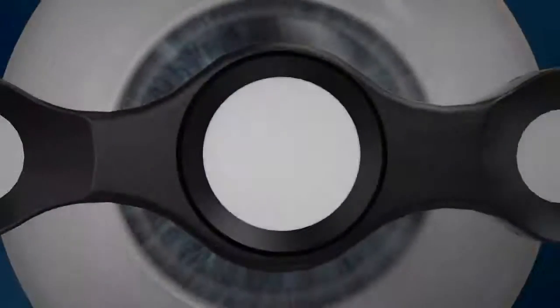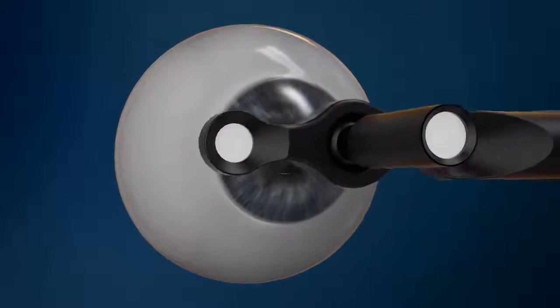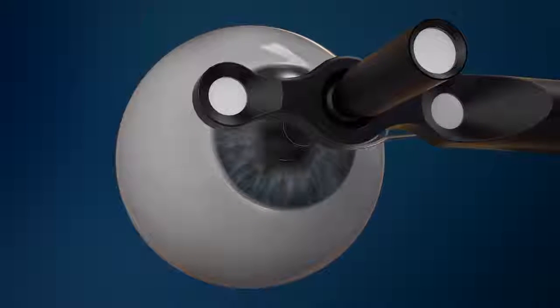The X-ray beams are directed to a position temporal and inferior to the posterior pole of the optical axis. This shift targets the X-ray beams onto the fovea. A low-power aiming laser is used to perform a check which ensures that the iris and the lower eyelid are not in the path of the X-ray beams.